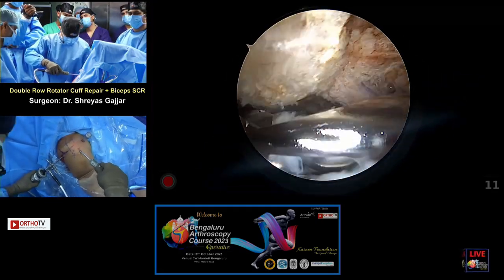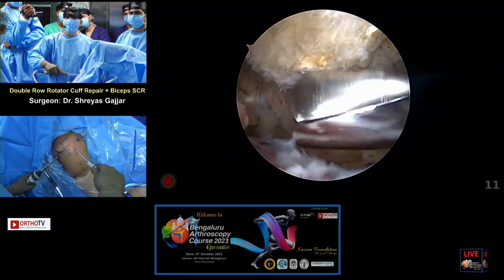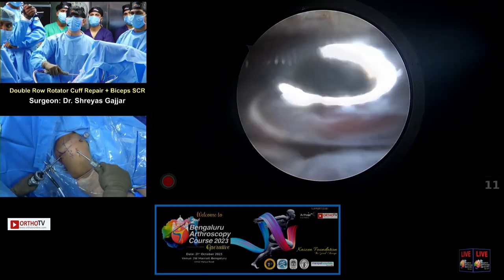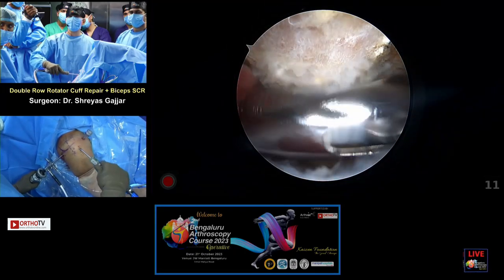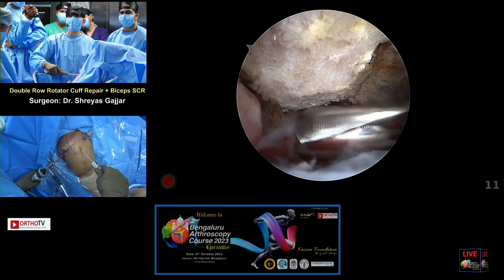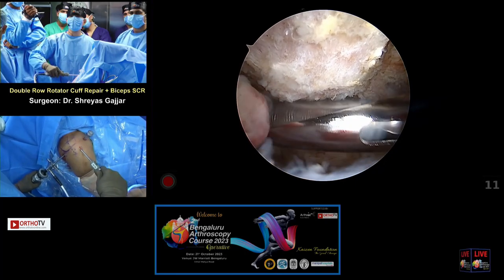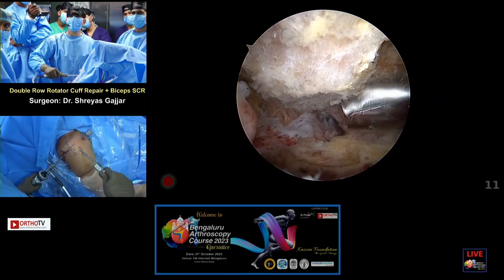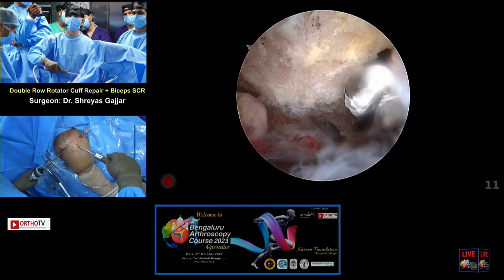So what percentage of your cases do you need to do acromioplasty? Unless it's a massive tear where the CA arch should be retained to prevent the anterior superior escape, I do it. As I said, very little. If there is an overhang of the anterior part, then I will just take it off to prevent any impingement, as seen here. So any evidence of coracoid impingement in this patient?